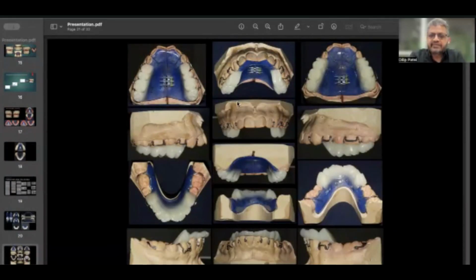It has an interdental eyelet clasp, an Adams clasp on the first premolar, and a half C clasp on the lower first molar, engaging the last molar, that holds the appliance properly and controls further flaring of the lower incisor.